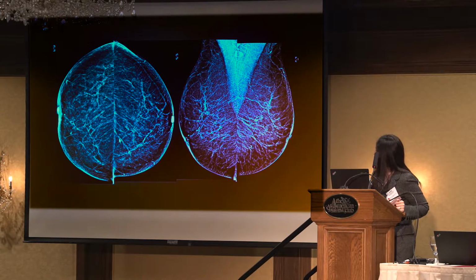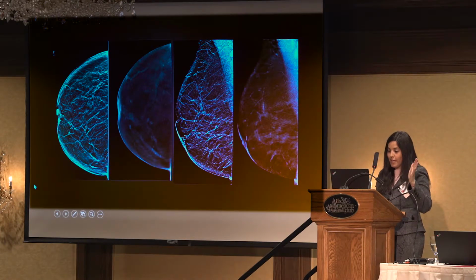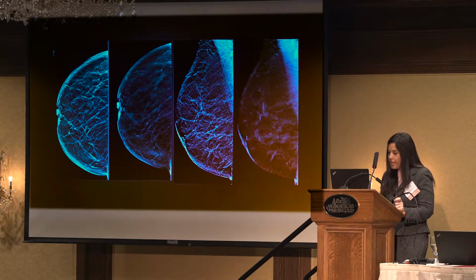You look at the 2D mammogram and you may or may not appreciate the abnormality depending on how long you look at it and what all the factors are, the light in the room, if the resident's talking to you. But let's play here. And there you see in the medial right breast at anterior depth.